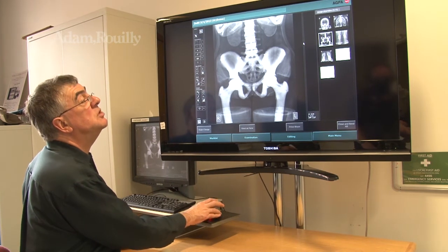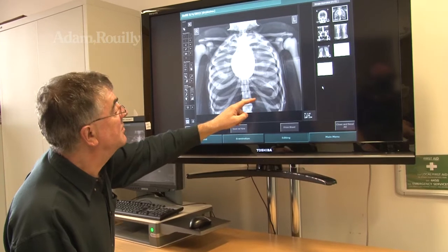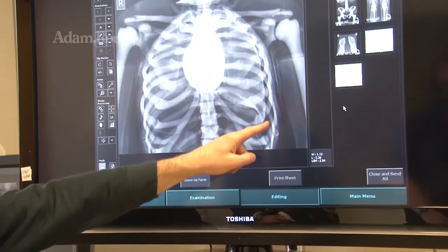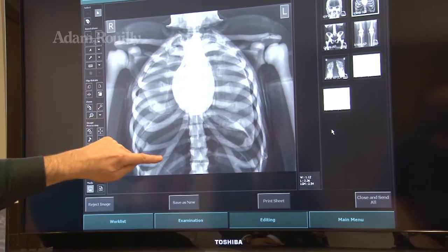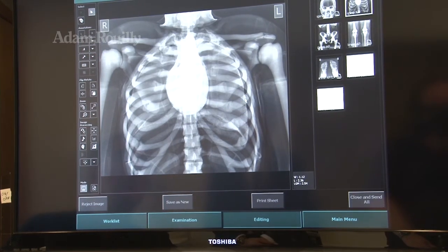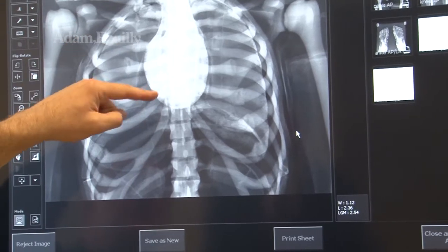And if I now go to the chest, which shows here at the bottom, we have the top of the kidneys. So I've got overlap on, and the bottom of the rib cage. We also have lungs. There is a lung margin and a lung margin there. To be a bit more precise, I will trace it down there, the margin with the cursor. And in the middle is a heart, which sits in the middle of the chest there.